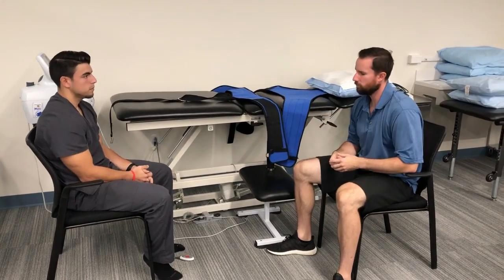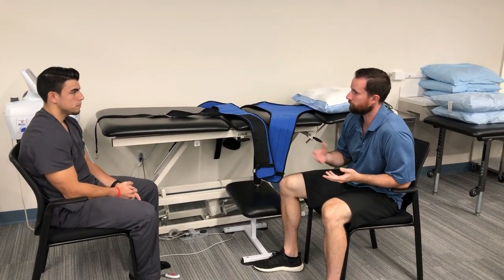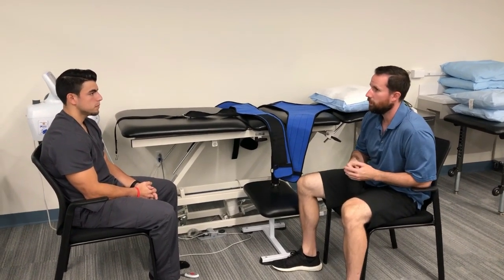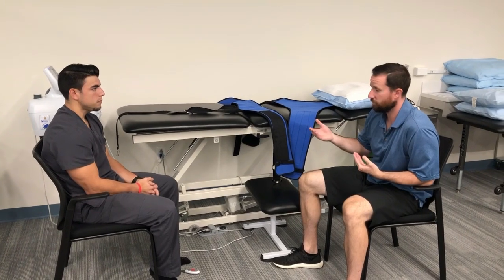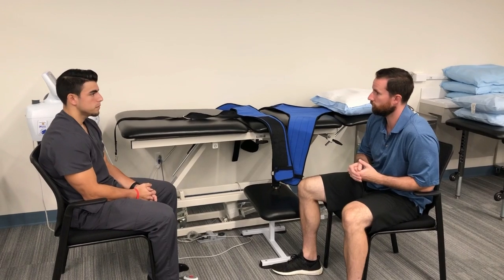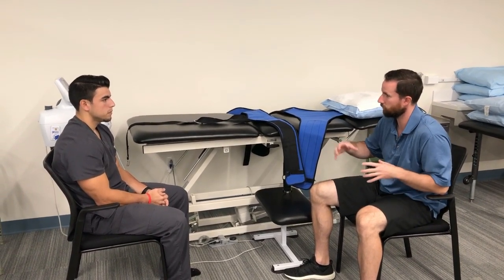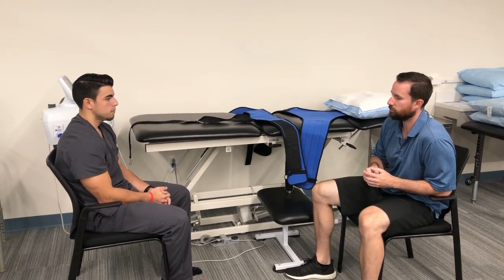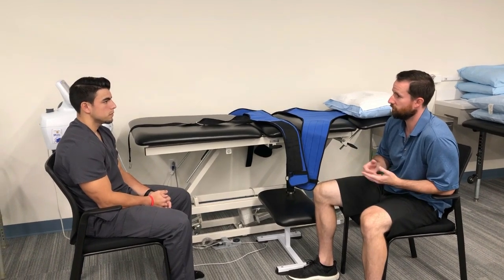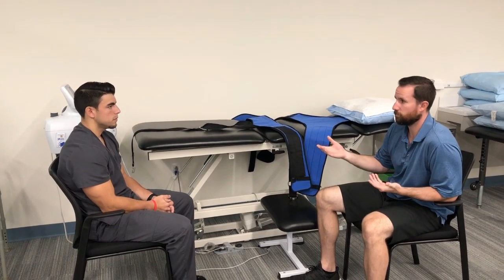Great. So from what I understand, you're having some back pain today as a result of degenerative disc disease of the lumbar spine. Okay. So because you're having pain in your lower back, and it's because of your degenerative disc disease, I want to do what's called traction. So traction basically works by pulling your vertebrae apart slightly, and this works by decreasing pain, by centralizing the pain of the discs, and by reducing muscle spasms by elongating the muscles in the area. So does this sound like something you'd be interested in doing today?